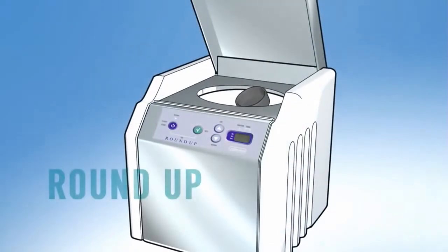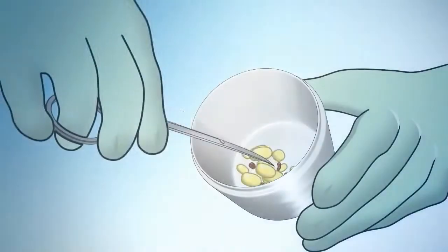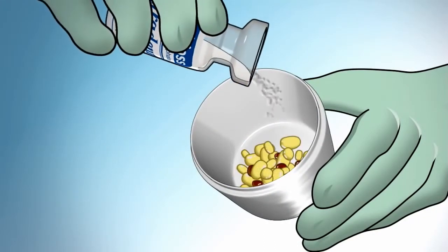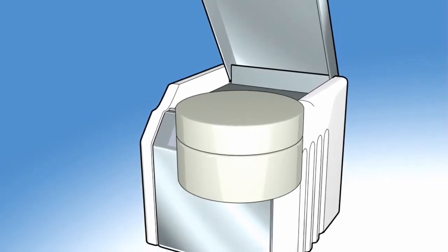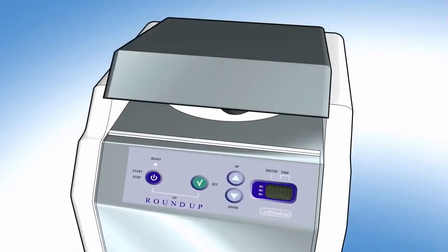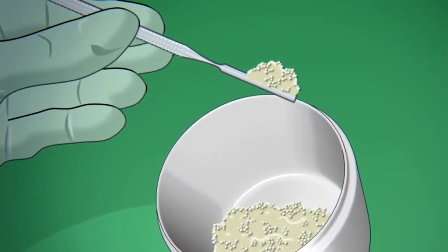The second way: mix CGF with bone particulate using the previously decontaminated roundup. Cut CGF into small pieces and put it into the metal container. Add bone particulate, close the metal container, insert it into its holder, and then put it into the roundup by starting the program. After a maximum of 16 seconds, you will obtain an integrated mixture of the two components.